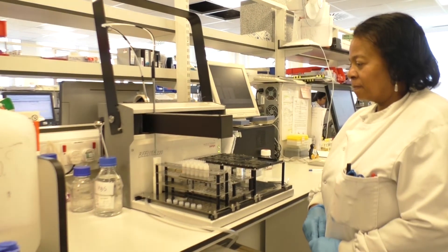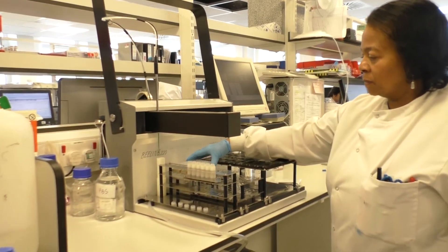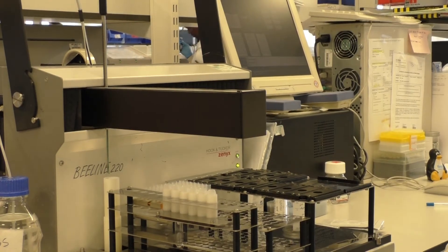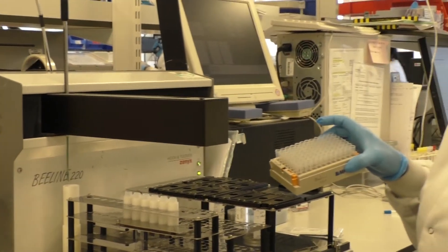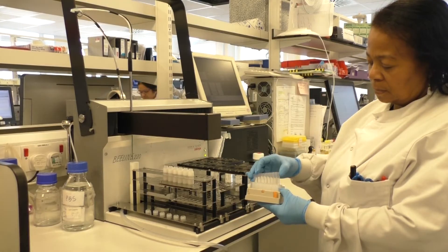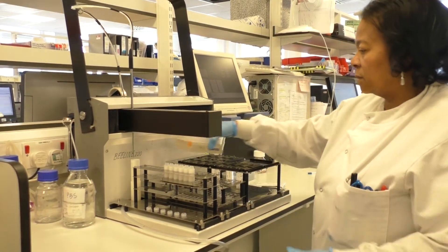They're put in a control rack because they're not diluted by the machine — they're put straight onto the slides. We have sample dilution tubes, which are placed in a special sample dilution rack on the machine, where the machine makes a 1 in 80 dilution of the patient's samples in PBS.